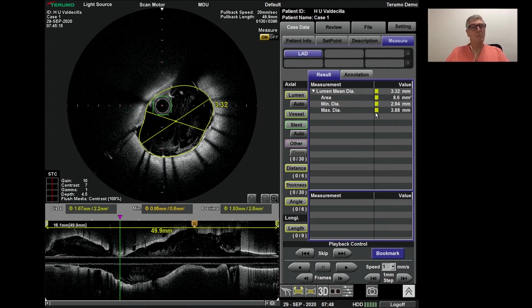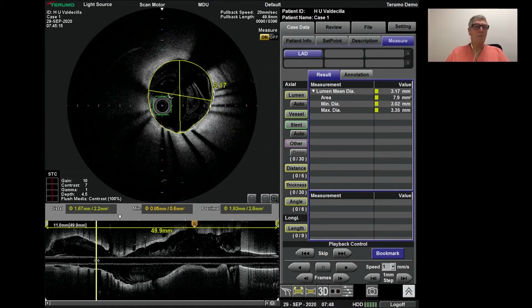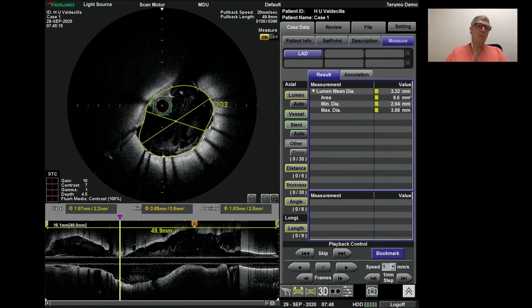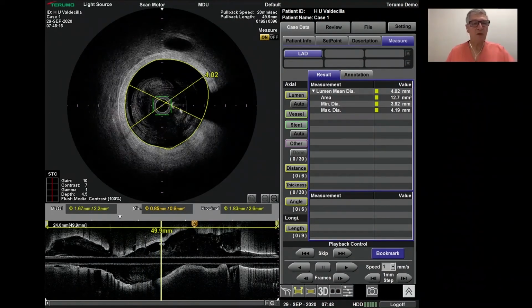So, muévete la bifurcación again. We're going to see where the circumflex is. Look at there, look at the wire is coming up at 12. Go para allá. Proximally. Look at there. Good opening to the circ and a good lumen. Then, Thierry, I think we finish. Absolutely, I like it very much.